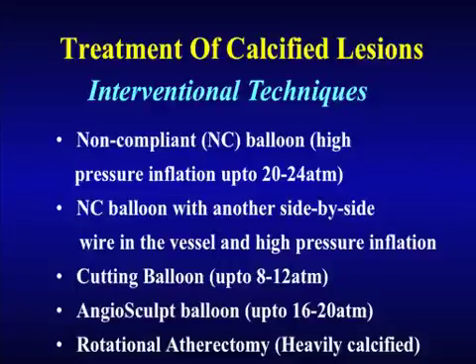This is like a patient with a heavily calcific lesion. Some little calcium, the flakes of calcium, is not important, meaning you can go ahead with your regular business of pre-dilatation. Don't do a direct stenting on those cases, but if you have a heavy calcium, like a chunk of calcium in this case, and of course we'll show it by the IVUS, you have a big arc of calcium more than 270 degrees. Those do not yield well just to balloon angioplasty, so you need to do some additional stuff.